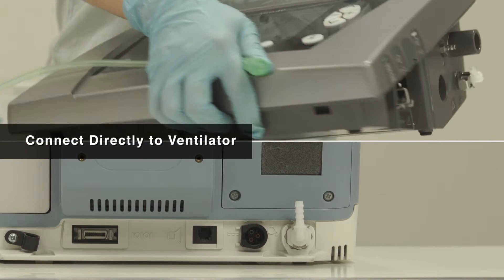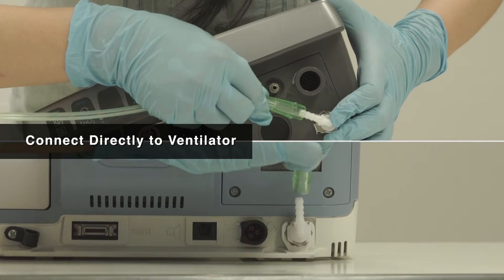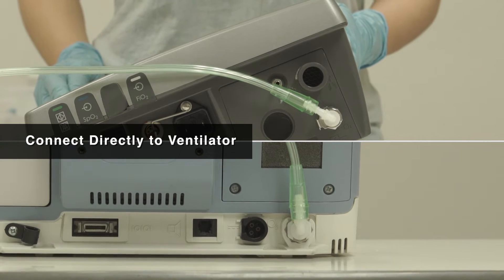While using the ventilator, connect the oxygen tube from the concentrator to the oxygen port of the ventilator as shown. The port can usually be found at the side or the back of the machine.